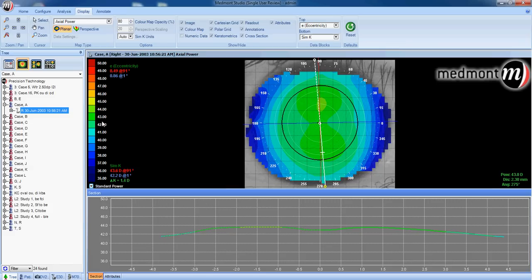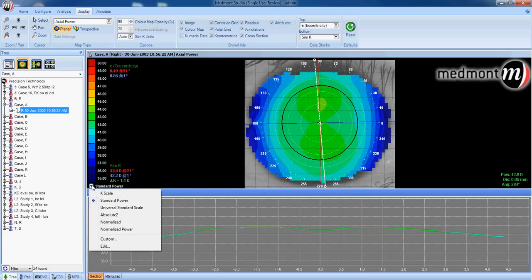But notice in absolute, you lose a lot of definition that the normalized scale would provide. So let's go back to normalized scale and use that as our default for all maps that we analyze.